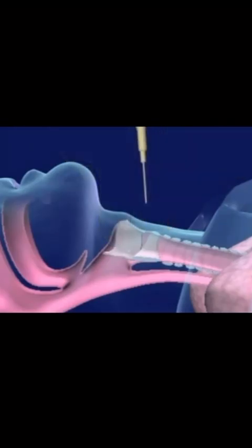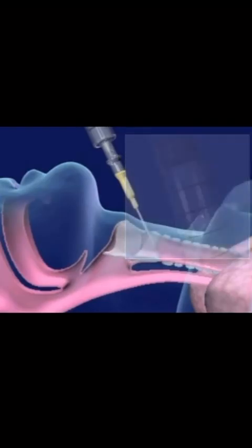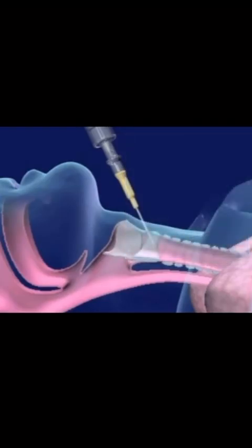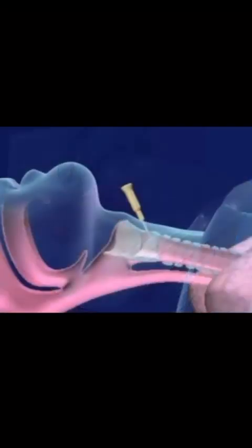Insert the 14-gauge cannula attached to the syringe filled with normal saline into the membrane at a downward 45-degree angle. When the catheter reaches the trachea, a distinct pop can be felt, and air bubbles will appear in the syringe. Safely remove both the needle and syringe and place the needle in the sharps bin. Secure the 14-gauge cannula catheter to the site.